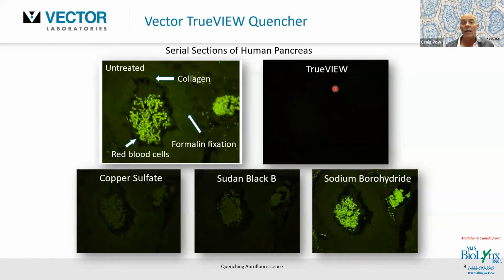This, believe it or not, is actually an adjacent section of human pancreas treated with TrueView. So it's one of these sections that does not have any specific staining, such as these, but treated with TrueView. And you get an appreciation of the drop of that autofluorescence when treated with TrueView.